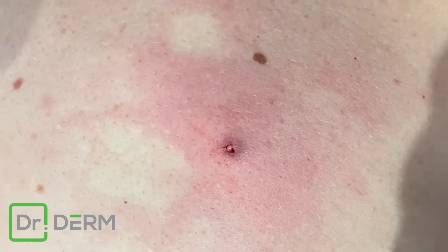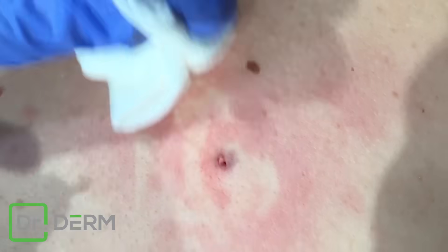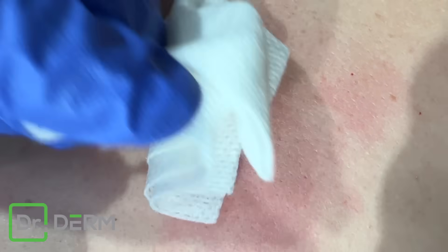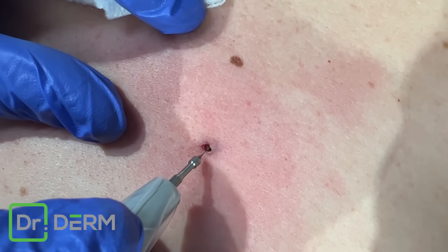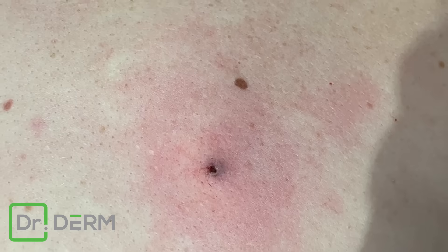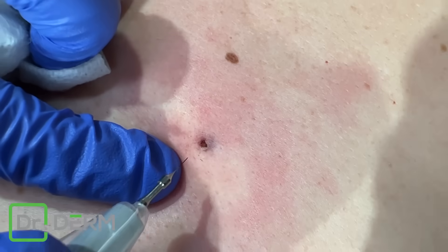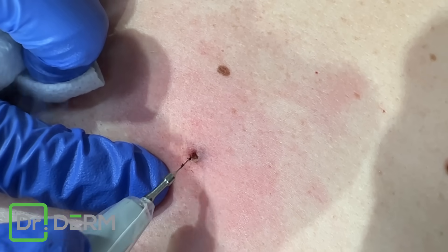So if I just go right in the center — my goal is to keep this from coming back and not make a big scar. There are some different methods to do this, but I want to keep small scars. That's always my goal. Things can look better with bigger incisions, but that's not necessarily better for the patient.